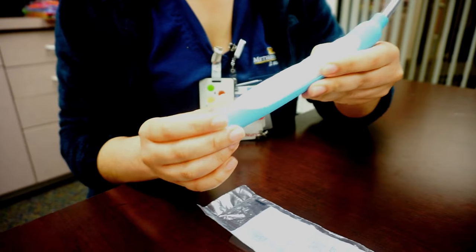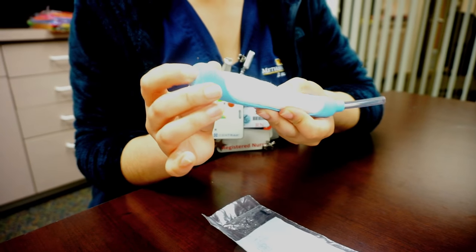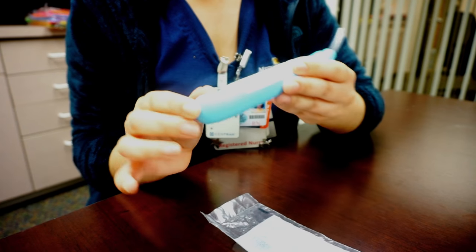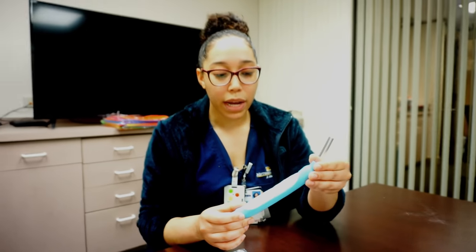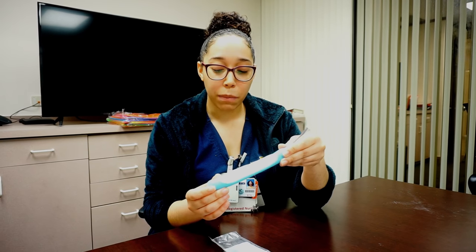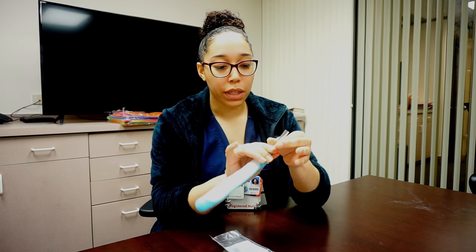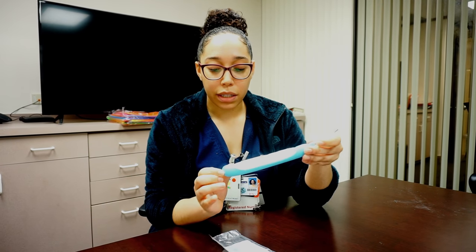In order for it to work properly, it has to have this space right here. You can kind of feel where the tube is. If this little space is not right here, it will not suction properly. That's the reason why it has to be set at 40 and not max suction. If you notice that it's not suctioning properly on your patient, you may need to pull this out a little bit and just make sure that space is there to confirm it's working.